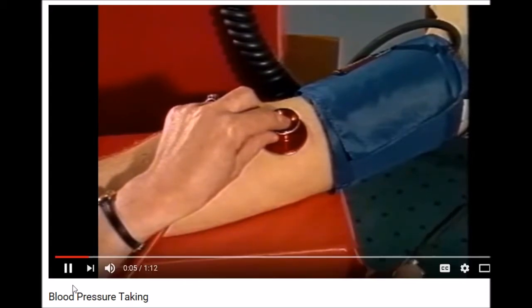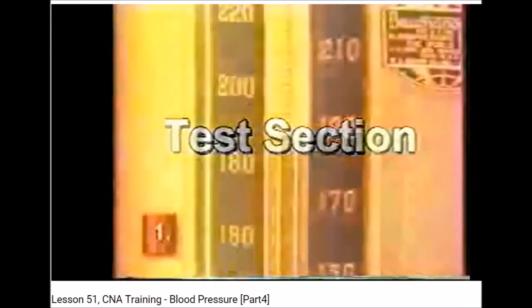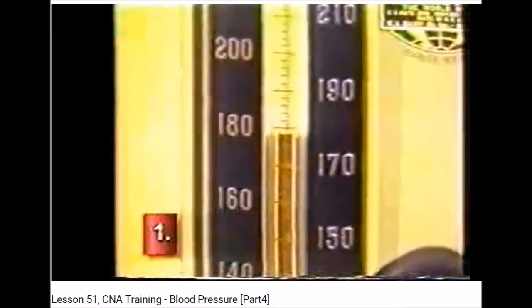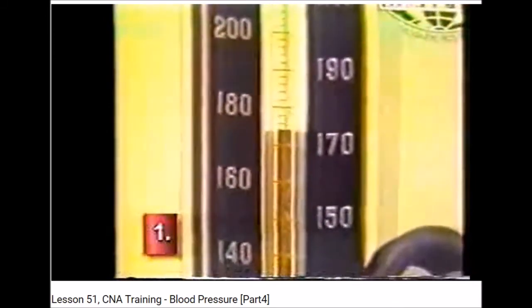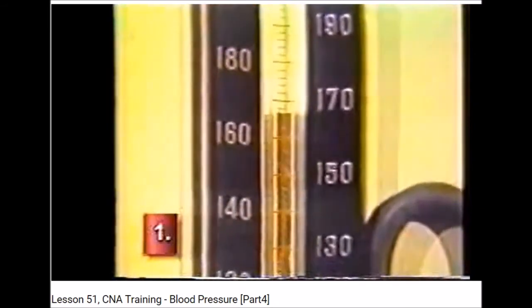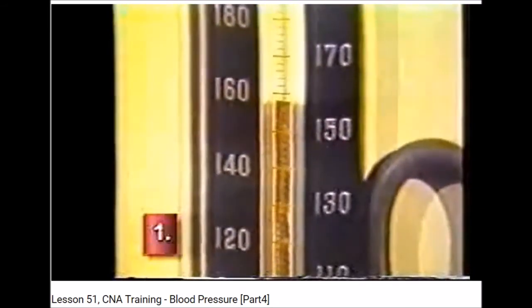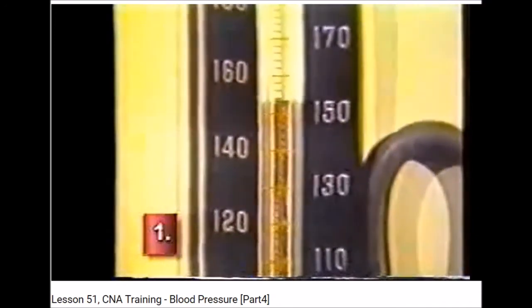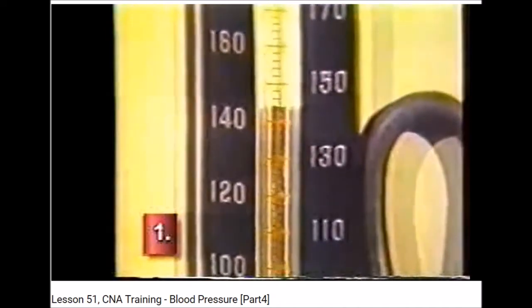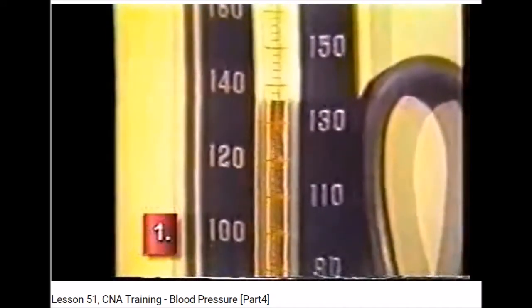heartbeat will be audible. So here you'll get a chance to pretend to be a nurse or doctor reading the blood pressure of a patient. There's the column of mercury. What you're listening for is the first sign of a heartbeat. And you'll hear it right now. And you need to record the pressure at which you first heard the heartbeat, which was about 160 something millimeters of mercury. Now the pressure's dropping.